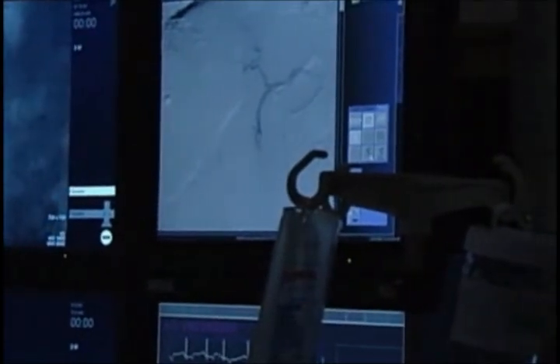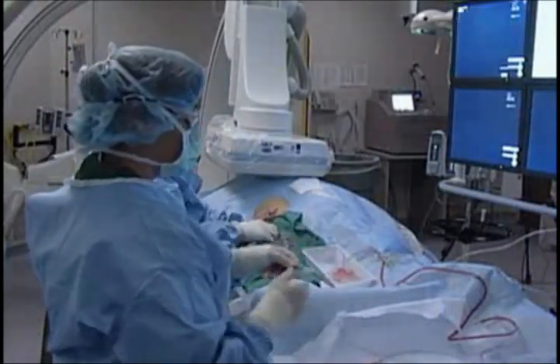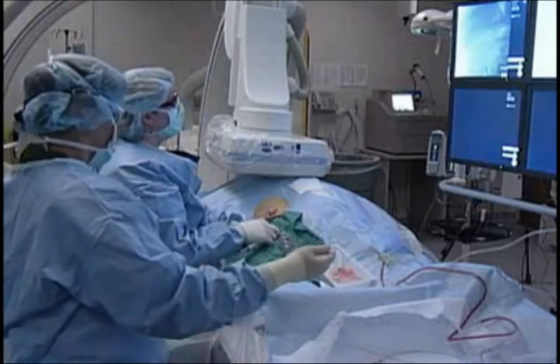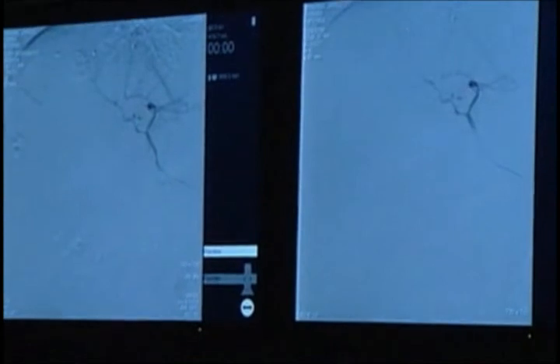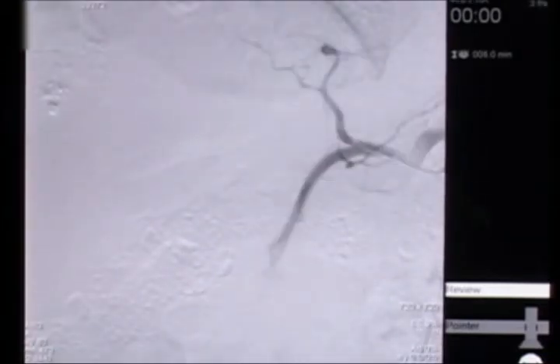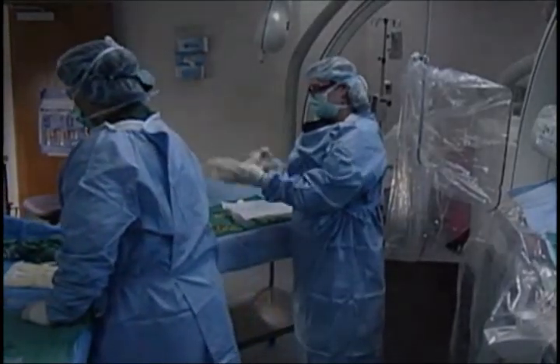That supplied the left or medial aspect of the tumor and has that same grayish tumor blush that we saw with the right. Those are the monitors that we're looking at while we're doing the procedure. Next we will be moving the catheter super-selectively into the area that we wish to treat. This will be a microcatheter placed inside a five French catheter, which allows us to get out farther into these small branches where we can do the treatment. That is the bifurcation of the left hepatic artery shown on the screen, which is where we're going to do the treatment for this procedure. Both of these vessels are supplying some branches to the tumor; if only one of them was, we would go out into just one to isolate it.